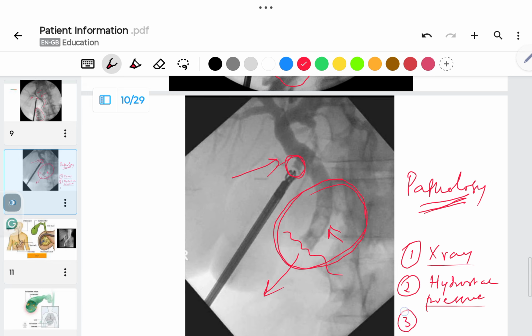The third thing is that the contrast itself may cause, in some patients, allergic reactions and some sort of, what I would basically say to my patients, transient liver injury. Omnipaque is not supposed to go into the liver. So when we inject something in the biliary system with increased pressure, which we create within the biliary system, and when we inject contrast, this can have some detrimental effect on the liver.